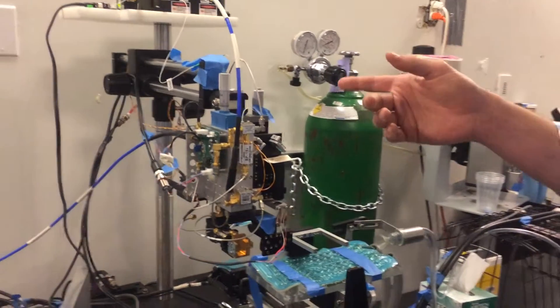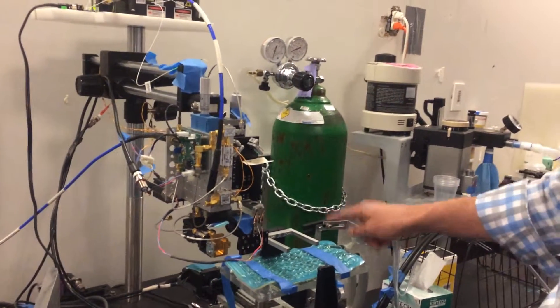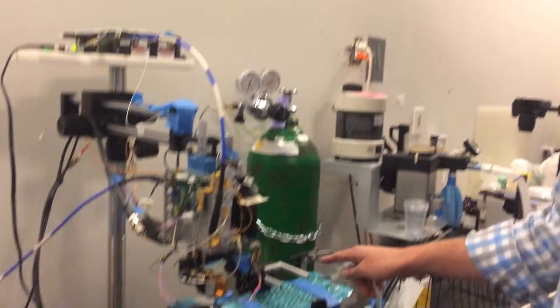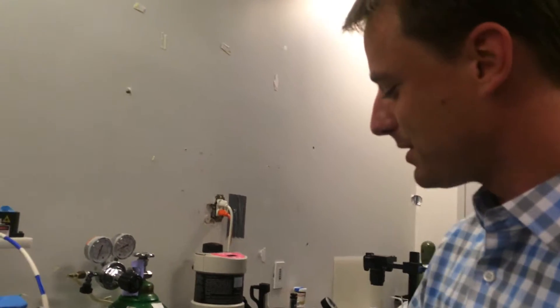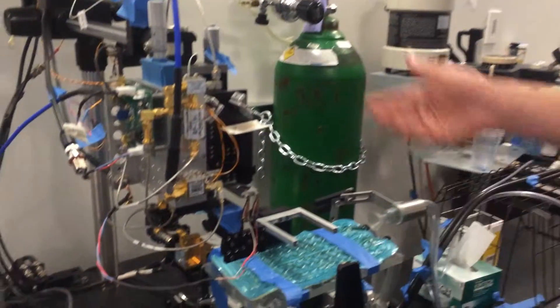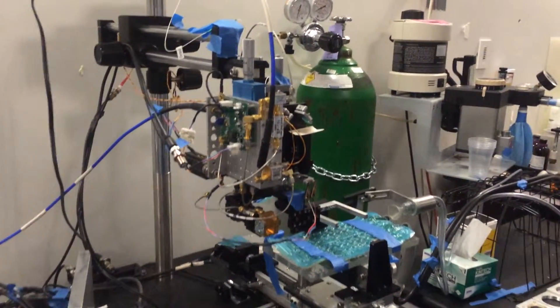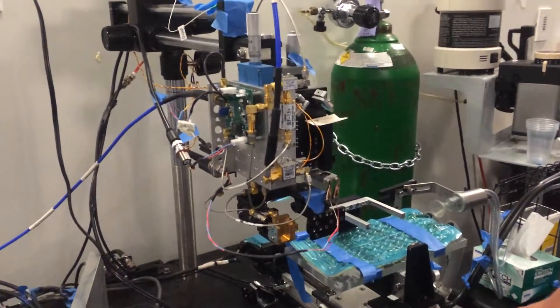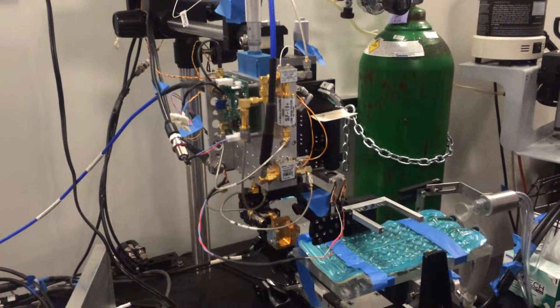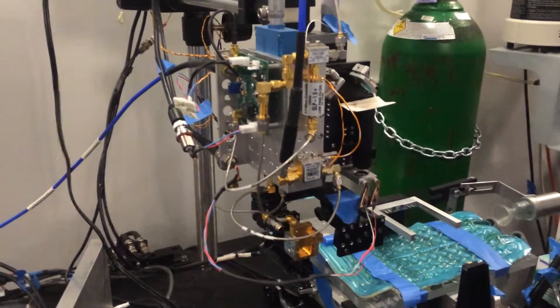It's not signal-to-noise limited. It's actually practical constraint limited because this animal's got a bunch of tubes coming out of it and sitting on it. And if you jerk it too fast, these things can just kind of fall out. The water dynamics don't seem to change so fast that you need to take an image any faster than five minutes.